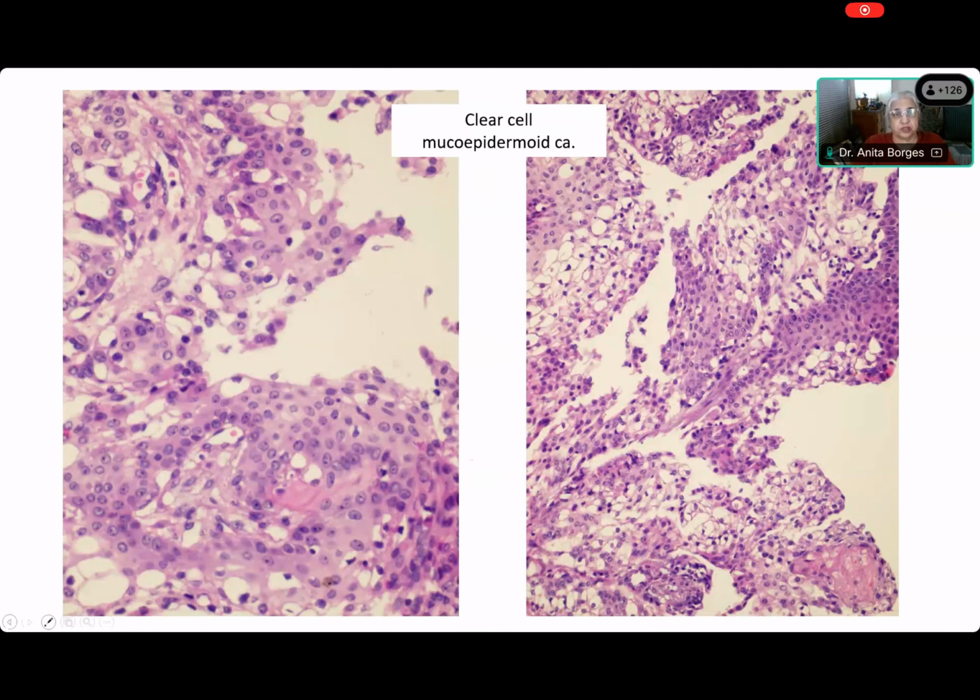But this is what is important. Okay, in a clear cell mucoepidermoid carcinoma, any mucoepidermoid carcinoma, nobody should make a diagnosis unless you see epidermoid and intermediate cells. There they are. And these are the intermediate cells, and you should see them. And if you're not seeing them, please, even if there's mucin in it, be very cautious about calling something a mucoepidermoid carcinoma. Remember that P63 can be expressed in mucoepidermoid carcinomas. So don't jump to the conclusion that P63 is expressed and therefore this is a hyalinizing clear cell carcinoma. No, mucoepidermoid carcinomas can also express P63. Of course, both will be CK and EMA positive.